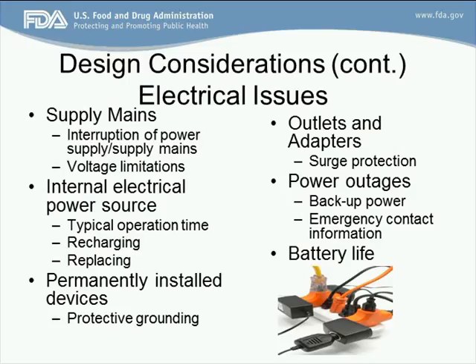Outlets and adapters. It's not safe to put a three-prong outlet into a two-pronged home, and you need to be designing your devices in accordance with that, understanding that that could be happening quite frequently, and looking at good surge protection. And then there's power outages.